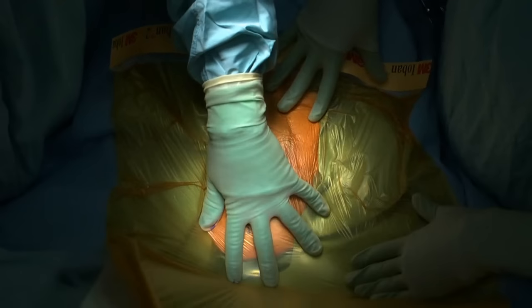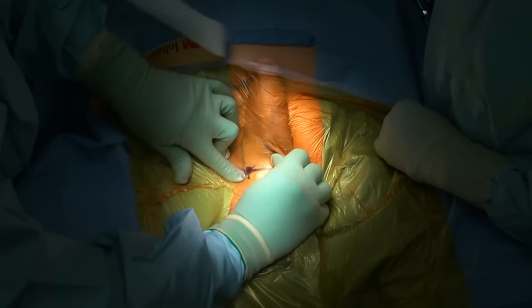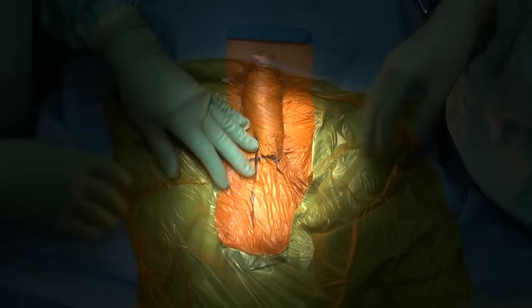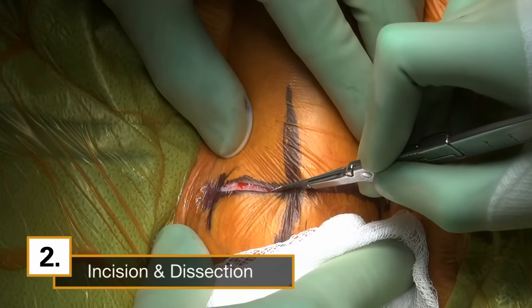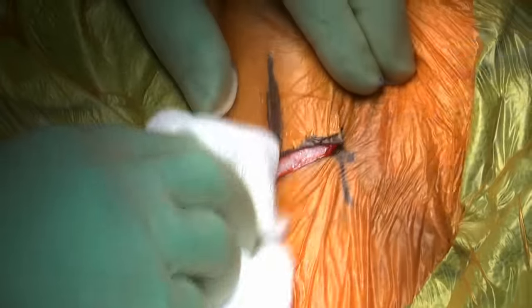Once the incision is marked, I conceal all of the exposed skin with an ioband drape. The ioband keeps the penis retracted while minimizing skin exposure. Then we place our Foley catheter. I make our incision with a 15-blade scalpel at the marked site. My entry into the scrotum and dartos tissue is brisk, clean, and hemostatic.